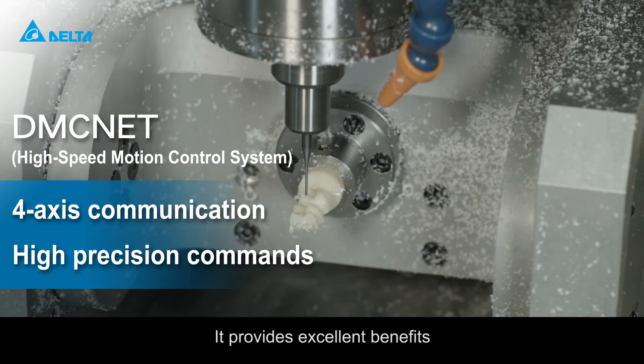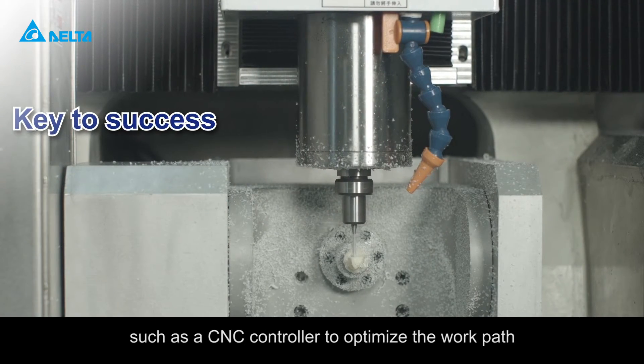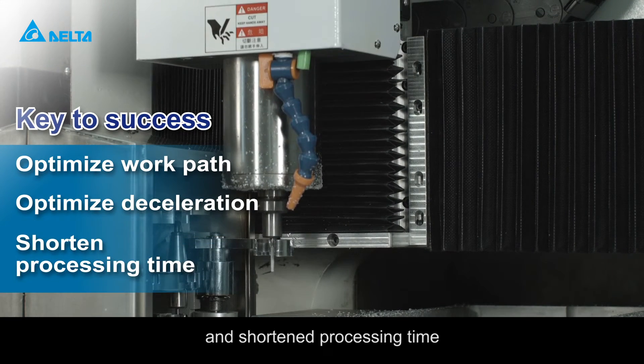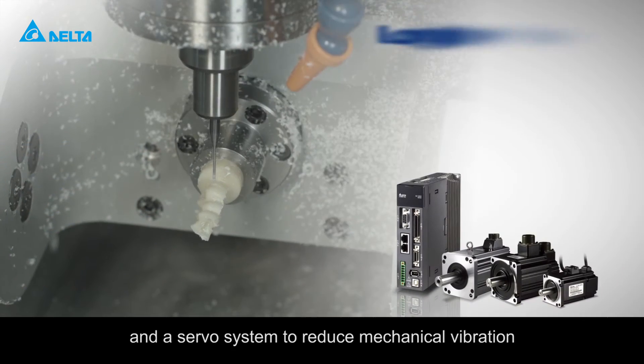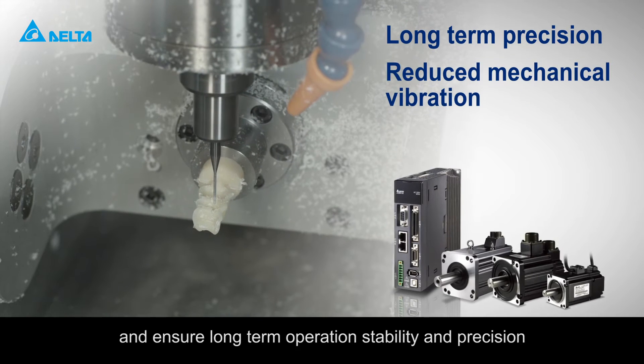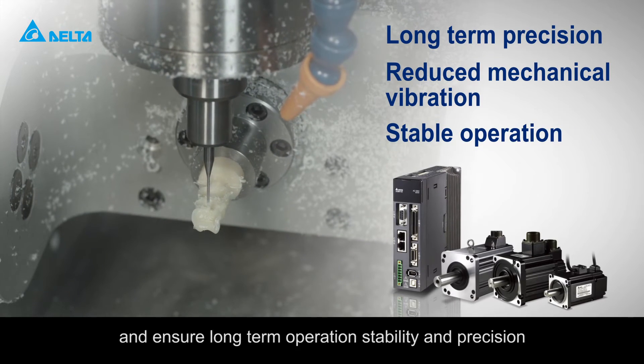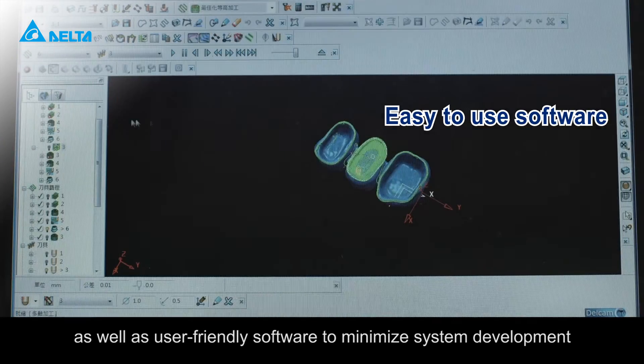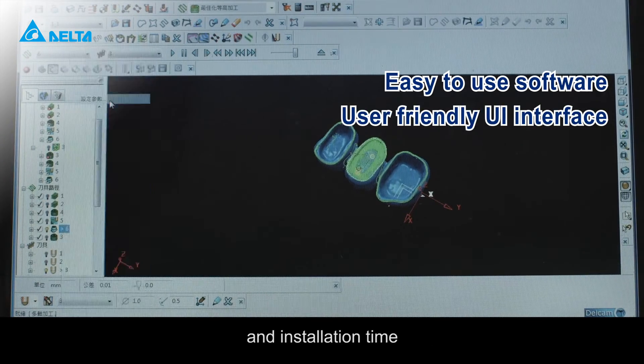It provides excellent benefits, such as a CNC controller to optimize the work path, lower deceleration frequency and shortened processing time, and a servo system to reduce mechanical vibration and ensure long-term operation stability and precision, as well as user-friendly software to minimize system development and installation time.